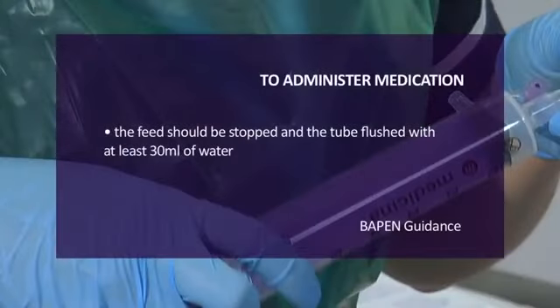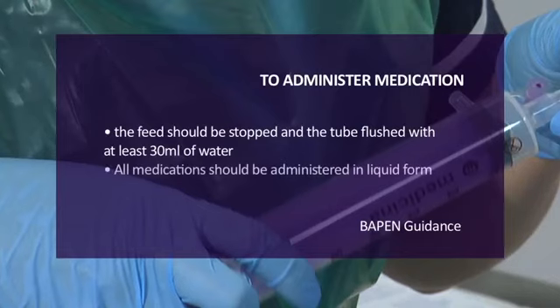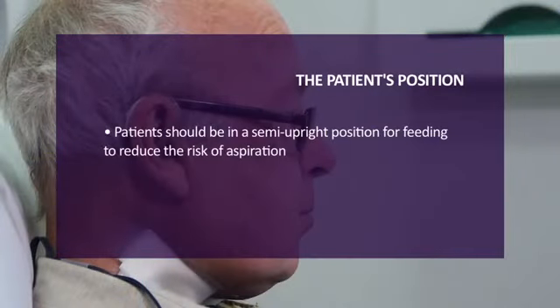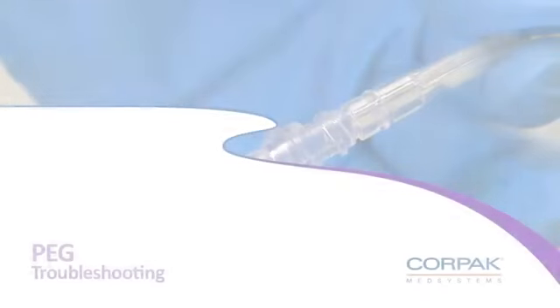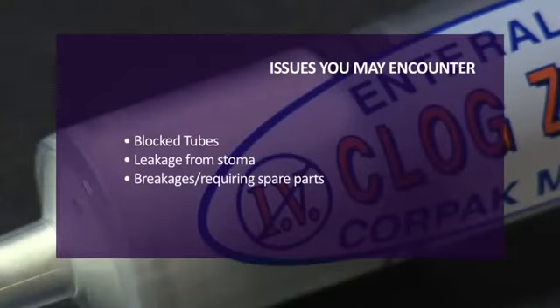To administer medication, the feed should be stopped and the tube flushed with at least 30 ml of water. All medications should be administered in liquid form. Patients should be in a semi-upright position for feeding to reduce the risk of aspiration. Within the first 4 weeks after PEG insertion, careful and thorough care of the stoma site is essential, and you can find out more in the next chapter. Some of the common issues you may encounter are blocked tubes, leakage from the stoma, and breakages requiring spare parts.